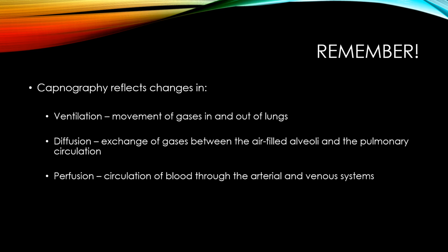So remember, capnography reflects changes in your ventilation, which is the movement of gases in and out of your lungs. It also reflects changes in diffusion, which is the exchange of gases between the air-filled alveoli and the pulmonary circulation, and your perfusion, the circulation of blood through the arterial and venous systems.